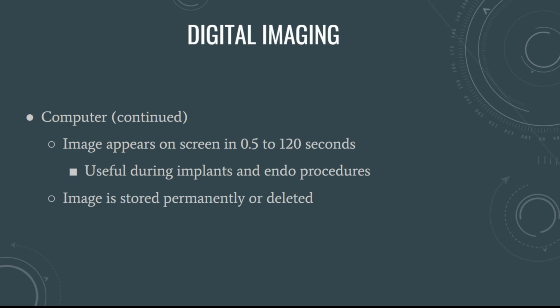Then the image is going to be stored permanently or deleted. Sometimes you will need to print them out if you might be sending them off for a referral or if they're maybe transferring to another office, or you can transmit those directly. So you can send them off through email to whatever office they may need to go to.